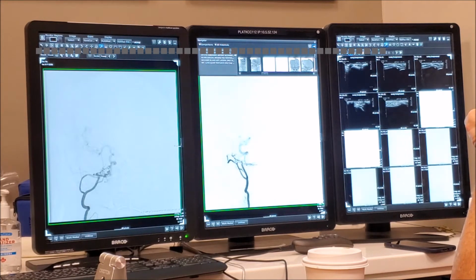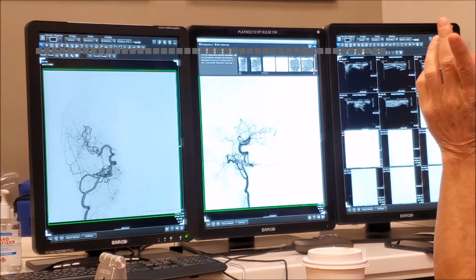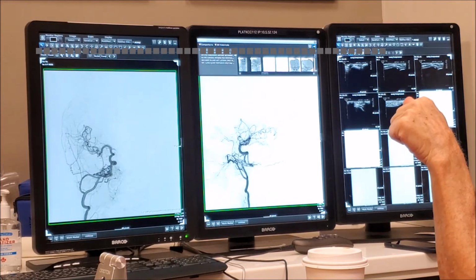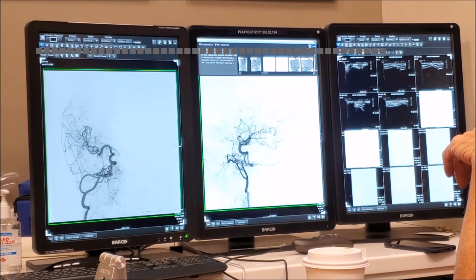See, coming like this may be the area from the foramen spinosum. Last week you differentiated between middle meningeal and accessory meningeal. I'm having problems. We know one thing: this is the internal carotid artery. One of you should go to the anatomy book and look at the stapedial artery. The evolution of the middle meningeal artery comes from the stapedial artery. So something went wrong here at that level. I don't recall. Maybe I should study it too.